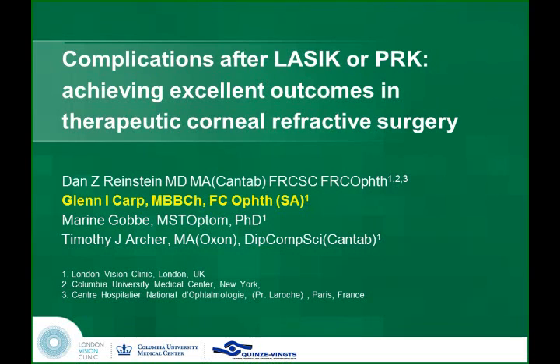Remember that some spherical aberration in the cornea is good. We want there to be spherical aberration. And if you want to know why, you can come to the presbyopia talk that I'm doing tomorrow on Presbeyond or laser blended vision, where we use spherical aberration to increase depth of field of the cornea, which is of benefit for presbyopia. So the issue here is controlling the amount of spherical aberration, or in this case now, reducing it if it's excessively high.